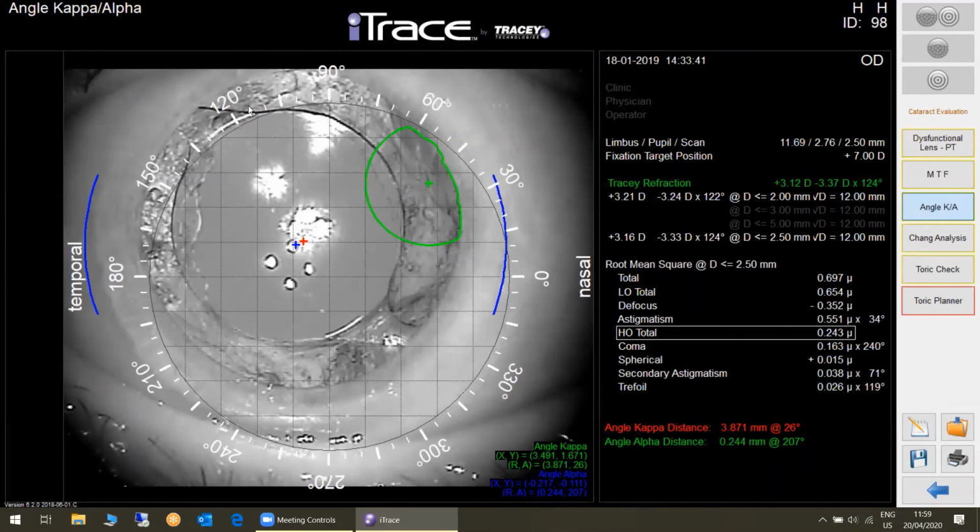And now you start to realize what happened. Probably during the surgery, there was a capsule rupture or a zonulolysis. And the doctor could not put the IOL in the bag. So he was looking for a sulcus lens, couldn't find one. And he took the biggest lens he had in his operation theater. The power was perfect. And then he did an optic capture.